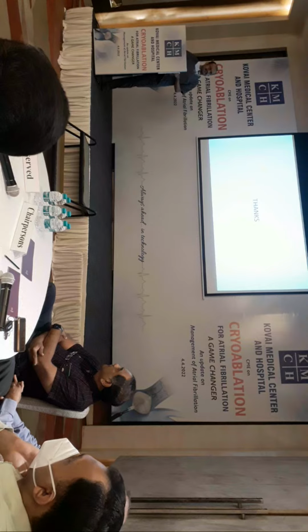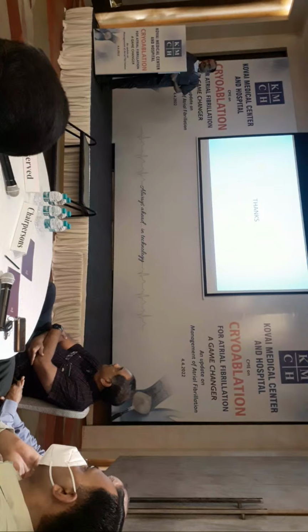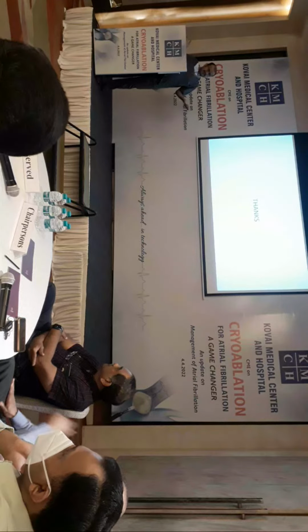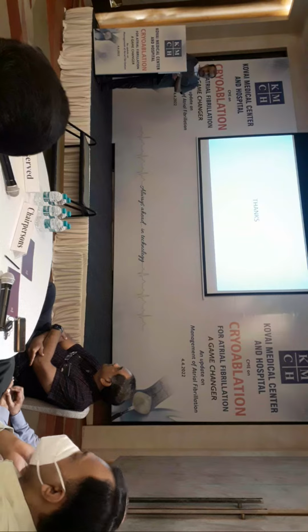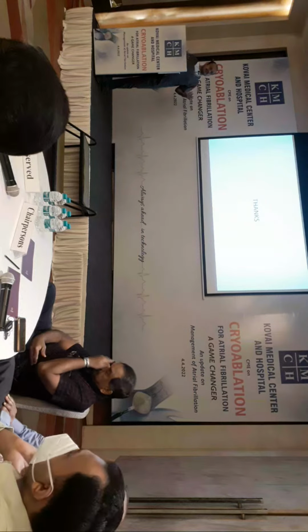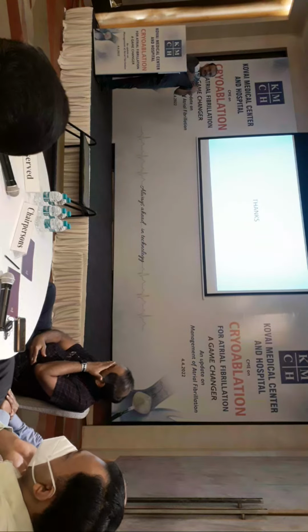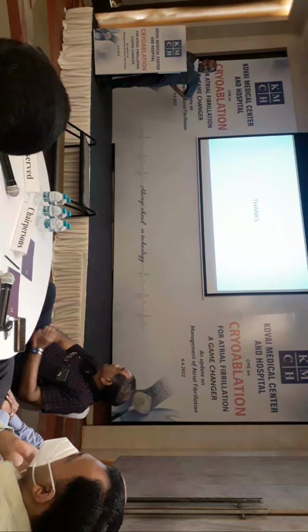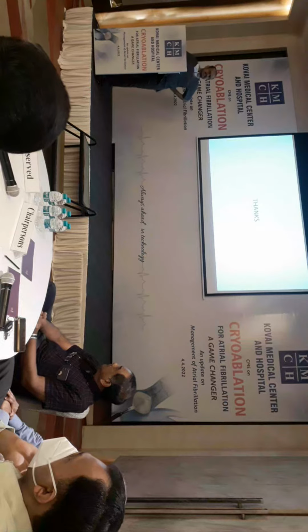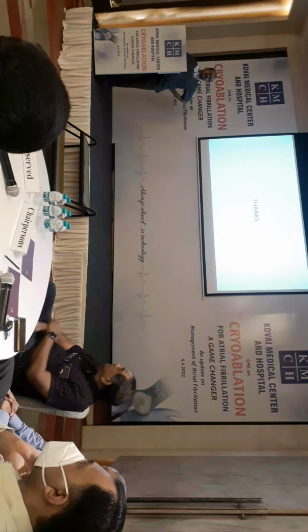Second is success rate, symptomatic and asymptomatic recurrences. I think PAF with cryo has a success rate of more than 70%. There are data available right now where they have done loop recorder implants. Again, your success rates are in the range of more than 70 to 80%, even with asymptomatic recurrences, where patients have no symptoms at all, but the loop recorder records it. There are also some patients with a pacemaker who go for an AF ablation, so you can easily pick up AFibs. So the success rate with PAF is definitely more than 70%.